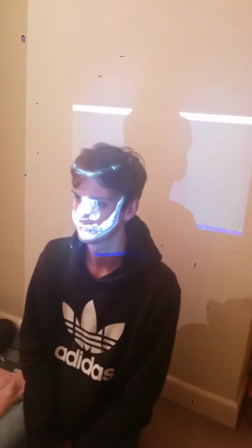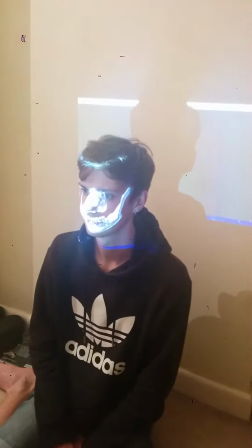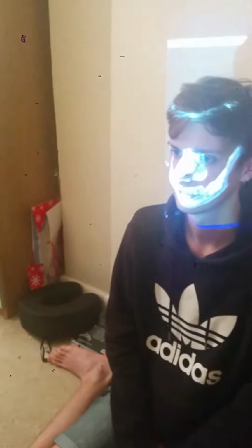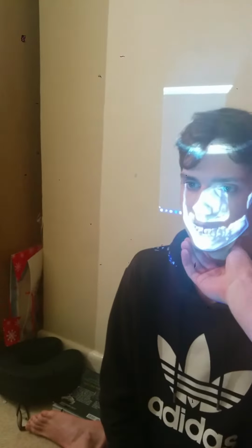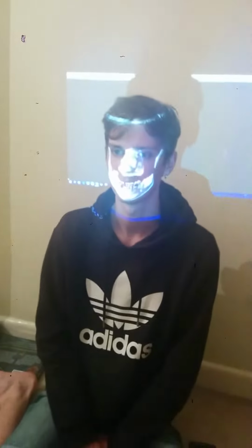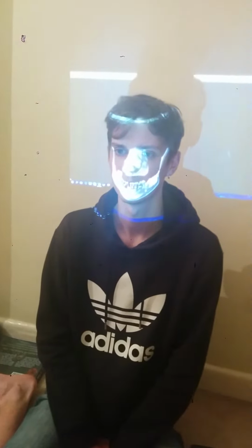Okay, and coming over to the patient, you can see that the STL file has been displayed on the patient's face. Unfortunately, at the moment, it's not in line, so what you would do is just slowly move the patient, go up a bit, tiny bit, thank you, and slightly back. And now, as you can see, the STL file is now perfectly displayed upon the patient's face.